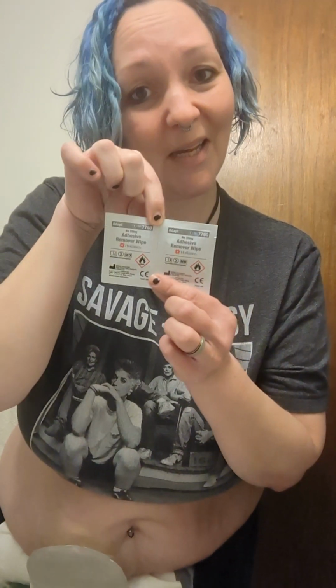and just show you what I've learned along the way, right? So my product situation right now, they no longer will allow me to get my spray adhesive remover. That works phenomenal. I am allowed to get these packets. So the spray, you just pull, you're good.